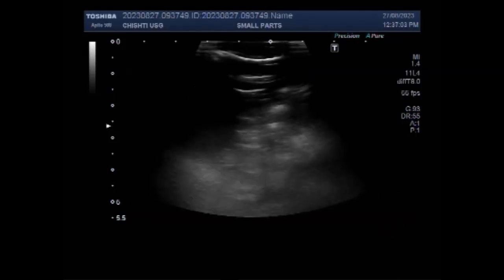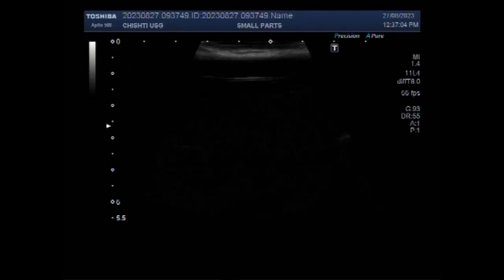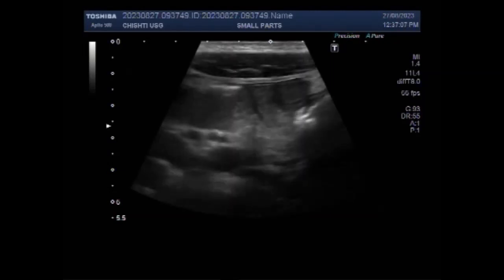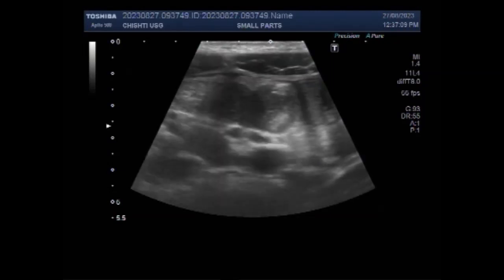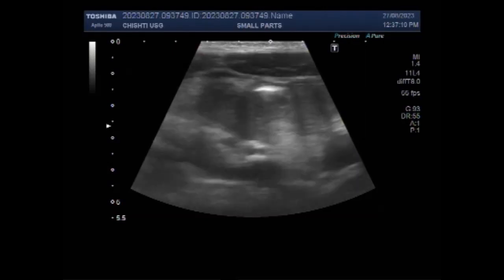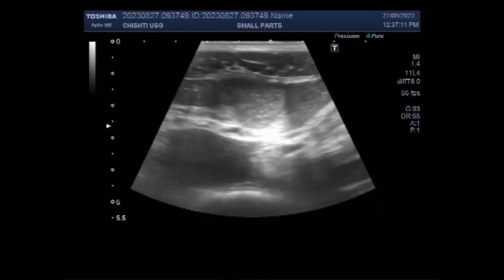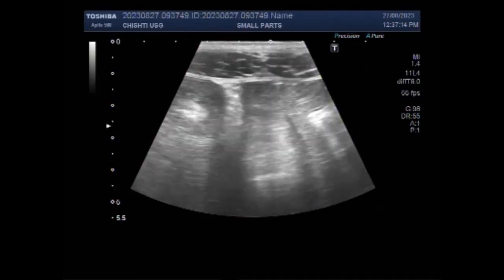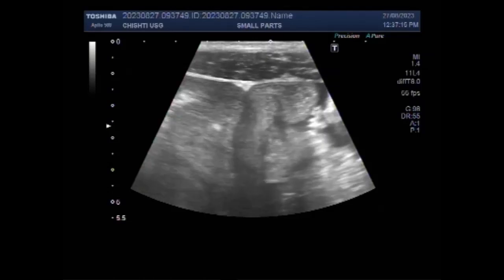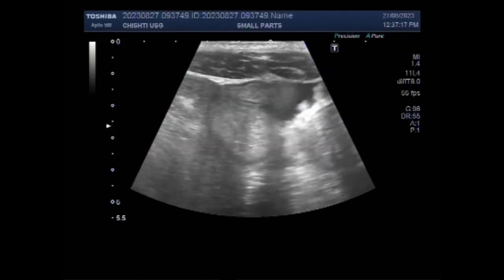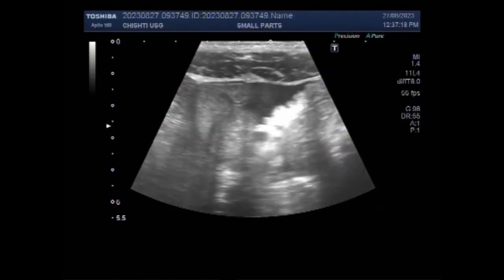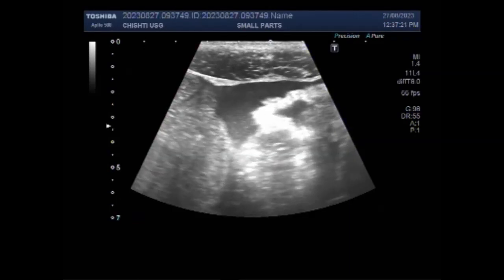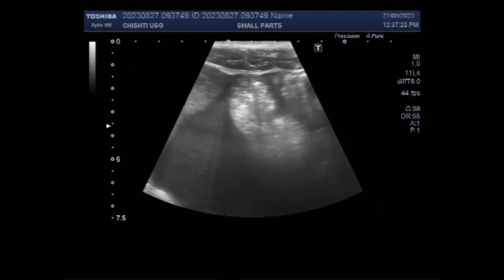Now you will see the scanning of this patient by a linear high-power probe. You can see the intestine, gut loops, and fluid is also seen.